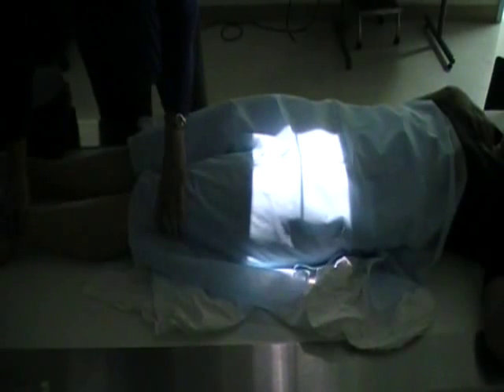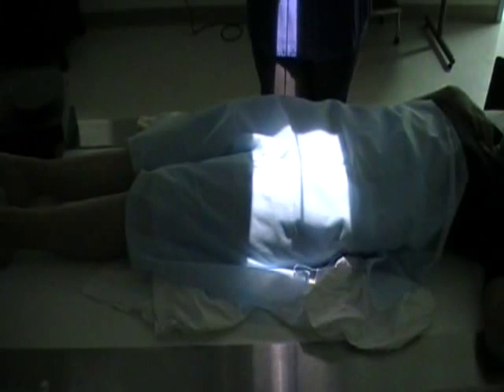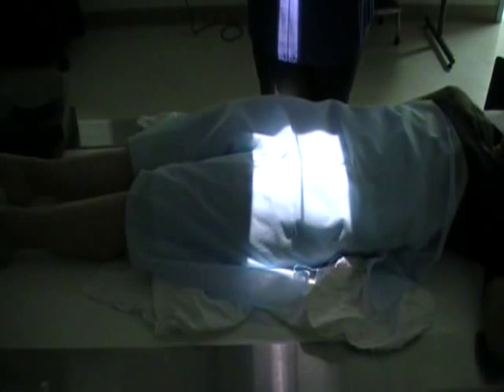Now, also for our AP hip, you want to roll the leg in 15 degrees. So just roll the whole leg in, and what this does, it rolls the greater trochanter out in profile, and the lesser trochanter is going to be rolled so that you cannot see it, or you may see just the tip of it. But this presents the neck of the femur best, which is an area which is often fractured.